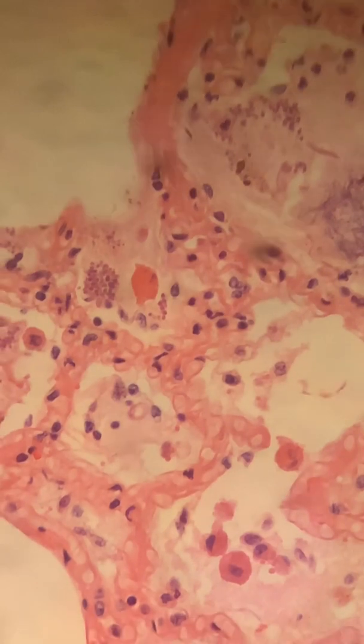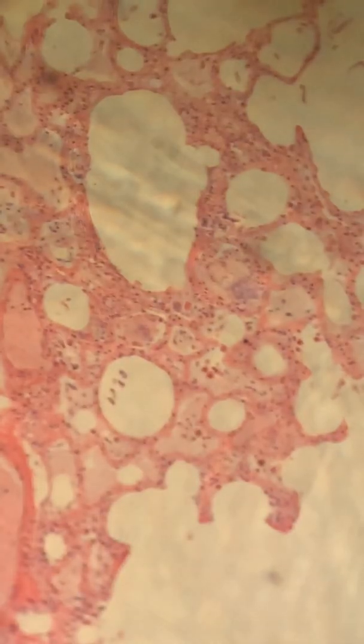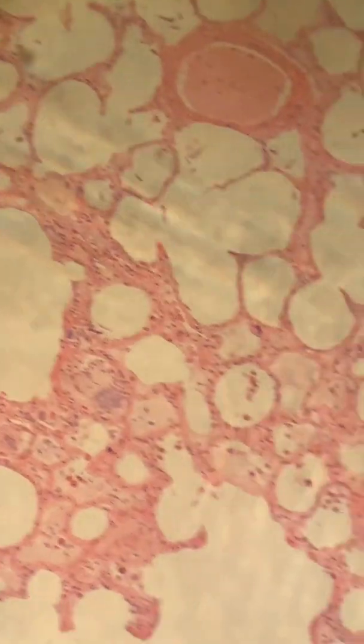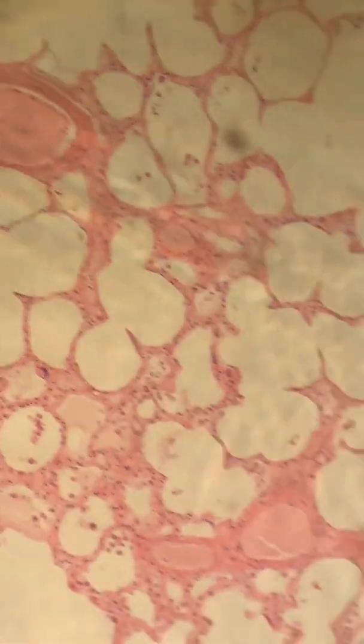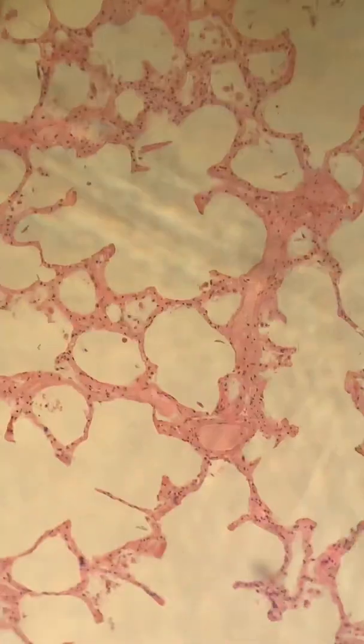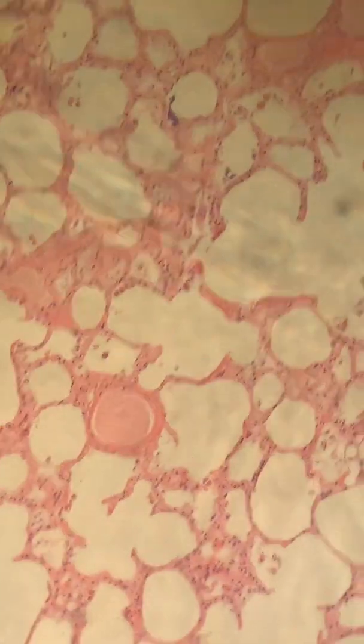And I'm going to scan around on a lower power view so that you can get a gestalt, an appreciation for the pneumonia and the organism. So I'm just going to scan around. You can see that for the most part the lungs don't look as bad, but there is definitely a pneumonia, as I will convince you, if not on this slide, on the next slide.